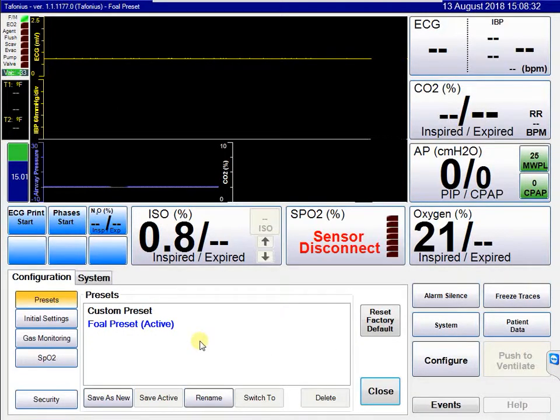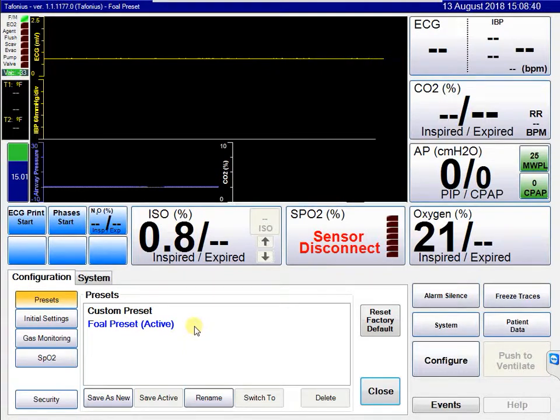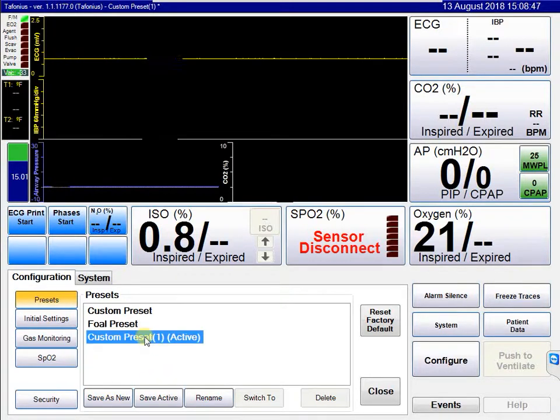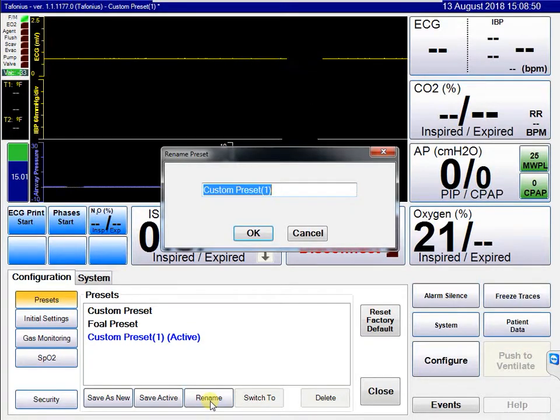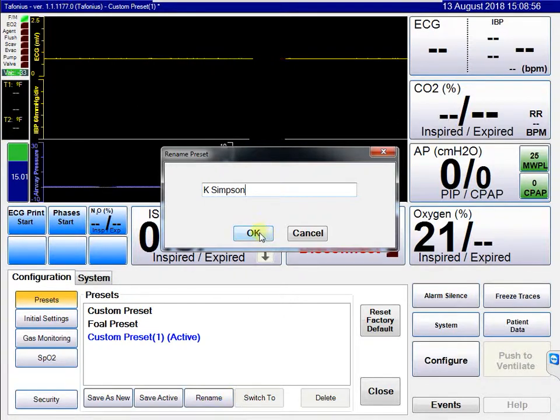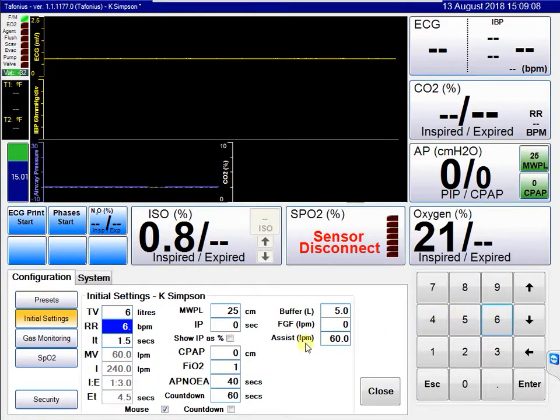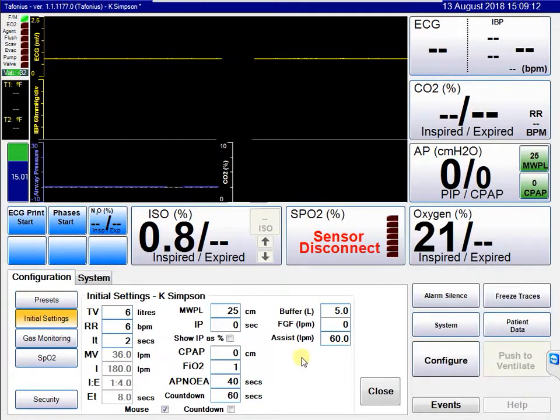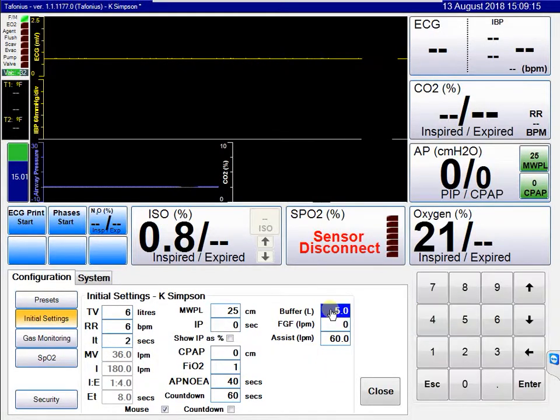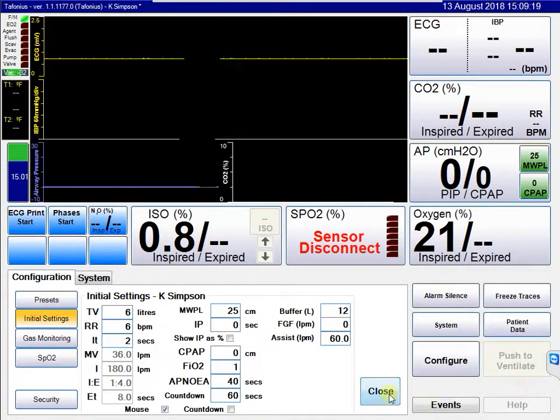You can create any number of presets. These can be related to an animal type, as shown, or to a person's own preferences. For example, saving a new preset and renaming it K Simpson preset means these would be your own particular preset settings to use as initial settings whenever you start the system. If you have a particular requirement — say, a buffer volume of 12 — you put that in, and these values will be used every time you select your preset.